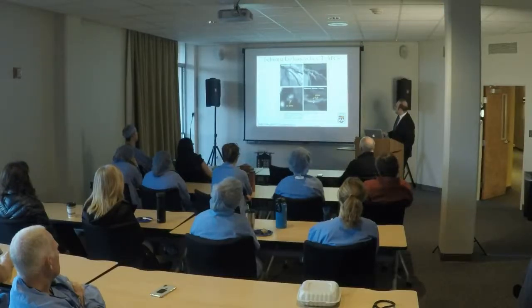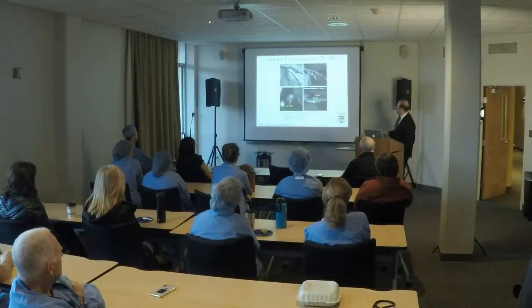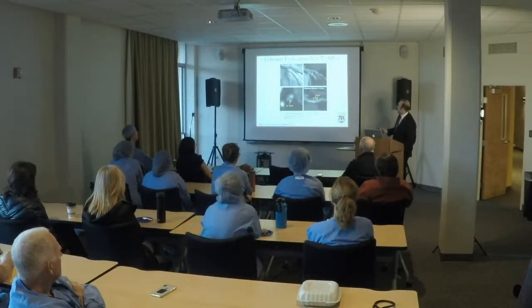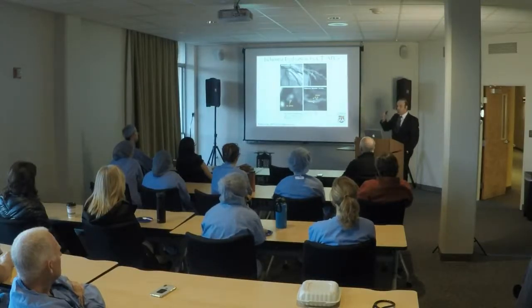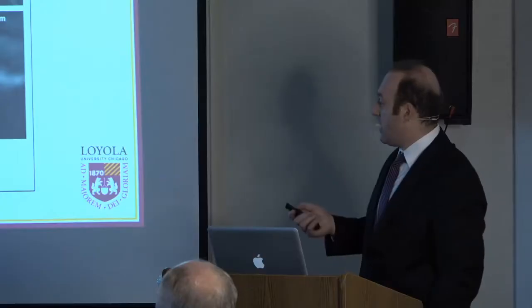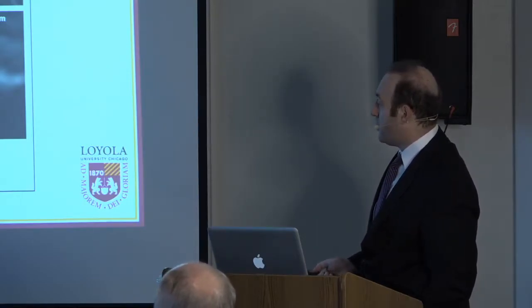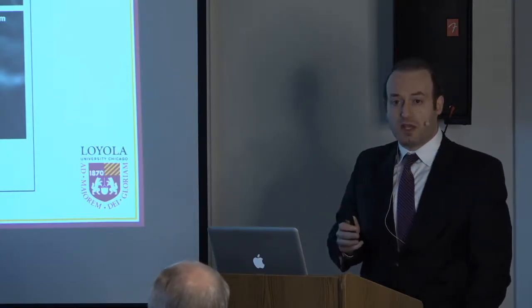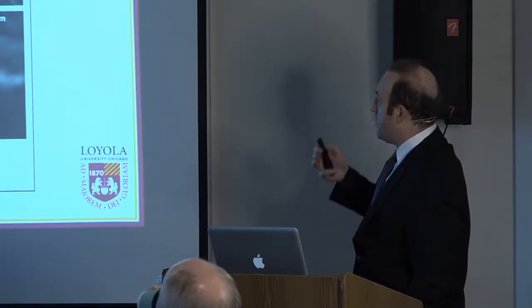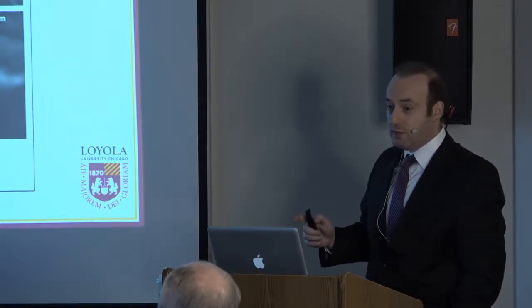And this is the same approximate LAD lesion. Again, the outward expansion, the positive remodeling, the low Hounsfield units. And this is another example of the positive remodeling here. This LAD, although it was considered non-obstructive, less than 50% stenosis, was an ischemic vessel. And we'll talk about FFR later on in the talk, but the FFR, the fractional flow reserve, was 0.76, below the 0.8 threshold that we typically use, suggesting that this non-obstructive vessel was ischemic.